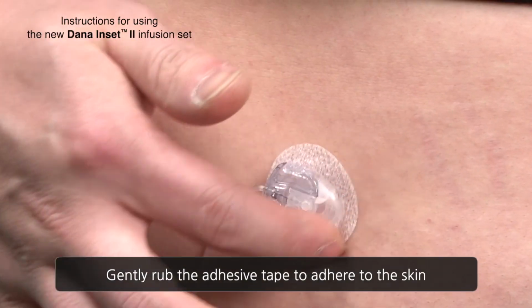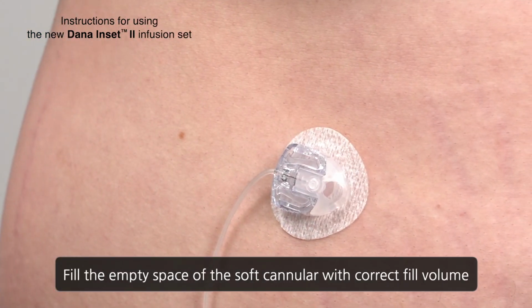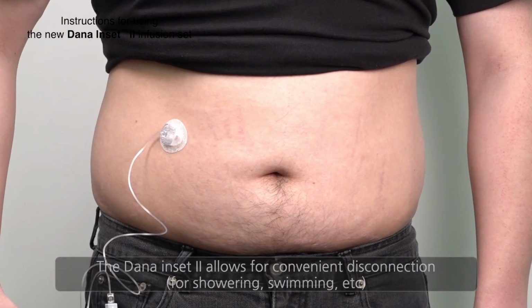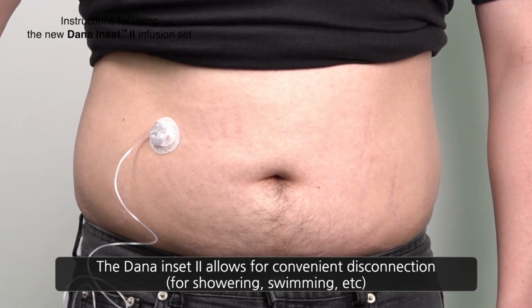Gently rub the adhesive tape to ensure good adhesion to the skin. Remember to fill the empty space of the soft cannula with the correct fill volume. The Dana Inset II allows for convenient disconnection, useful for showering or swimming.